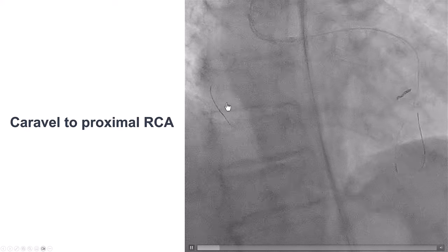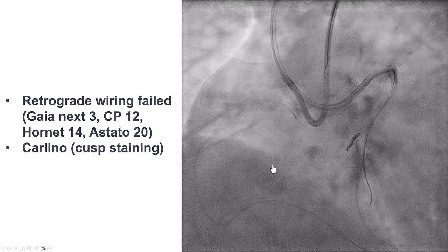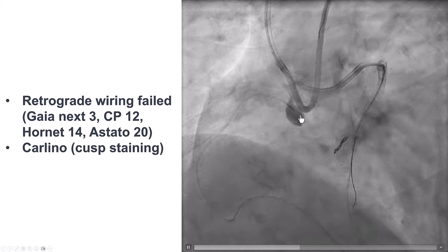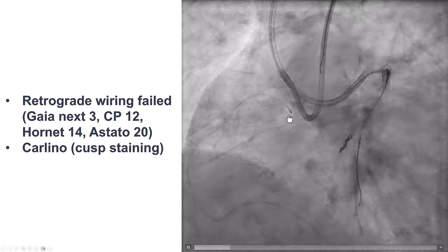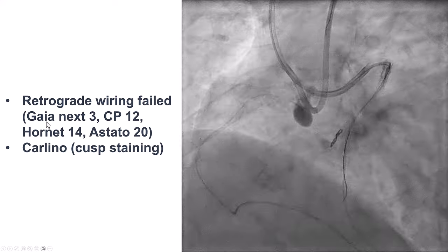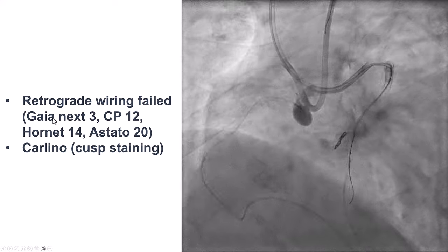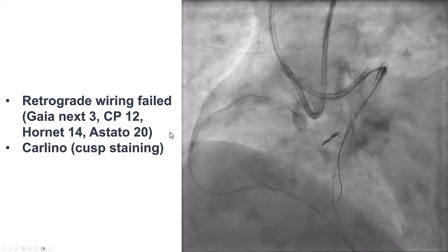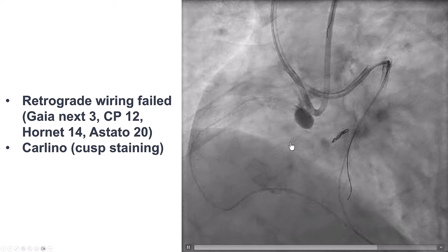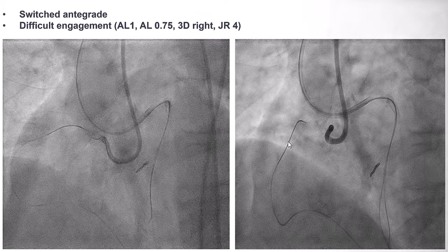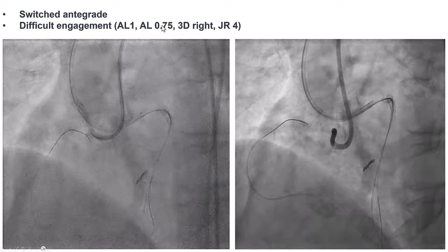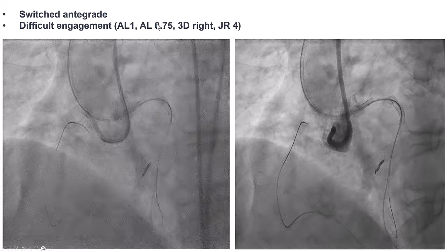After advancing the microcatheter, we were able fairly easily to advance a SUO3 wire into the right posterior descending artery. The wire advanced essentially all the way back to the proximal RCA. With the microcatheter literally at the ostium of the RCA, we were having a lot of difficulty with retrograde wiring. We could not puncture into the aorta despite using multiple highly penetrating wires. We performed the Carlino technique, which caused staining into the right coronary cusp. Clearly, we needed to engage the RCA but had a lot of difficulty with engagement.